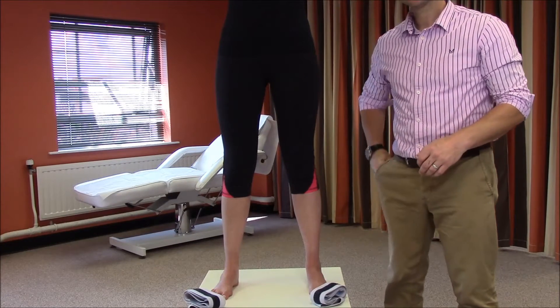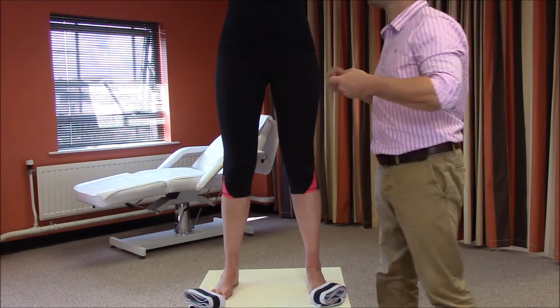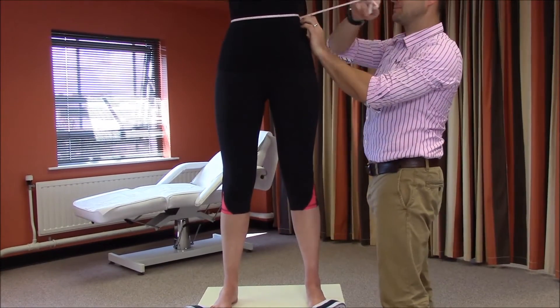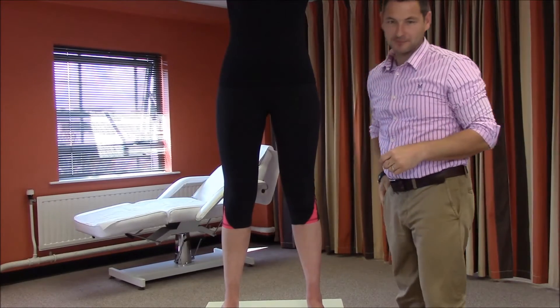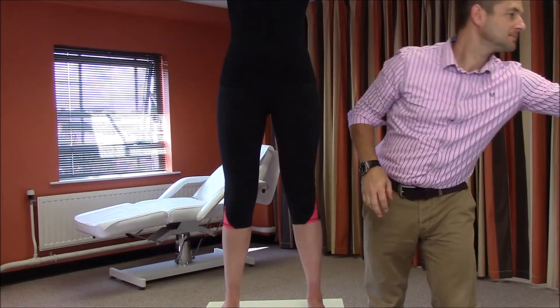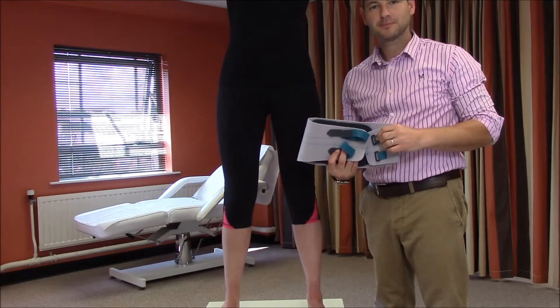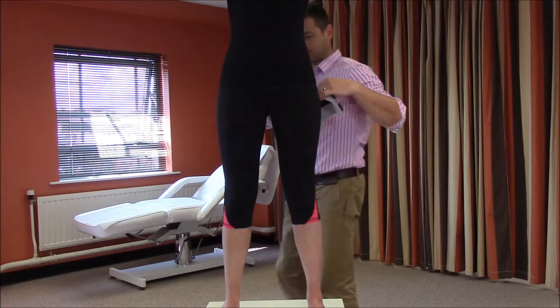In order to find the most appropriate size derotation band, begin by measuring the waist circumference in centimetres. Determine whether you wish to use a unilateral or bilateral design, and begin by donning the elasticated abdominal support around the waist.